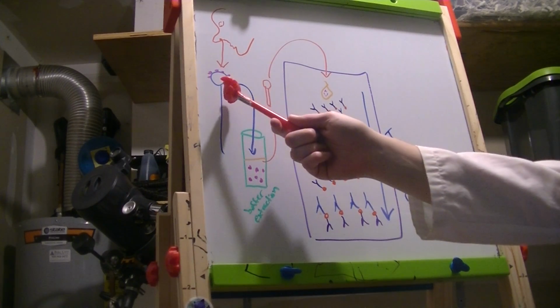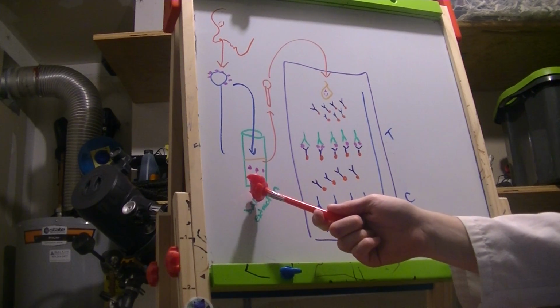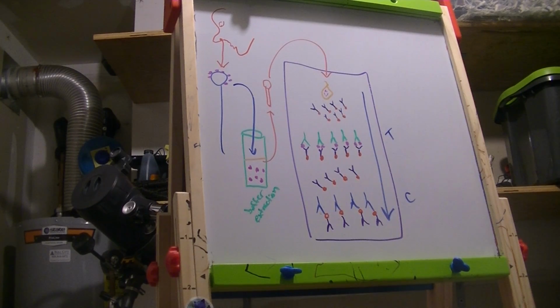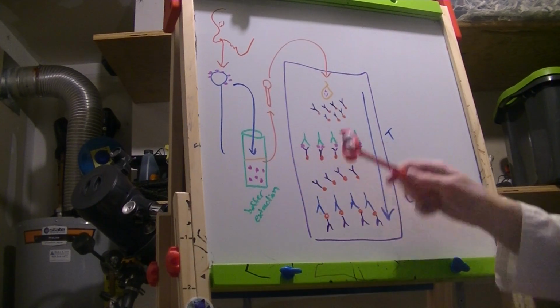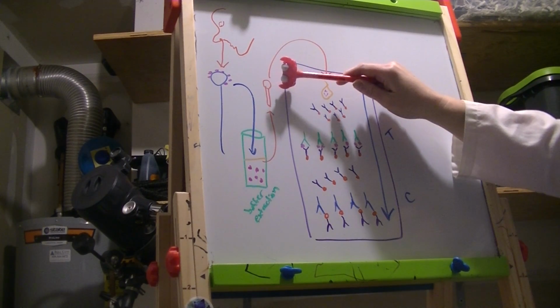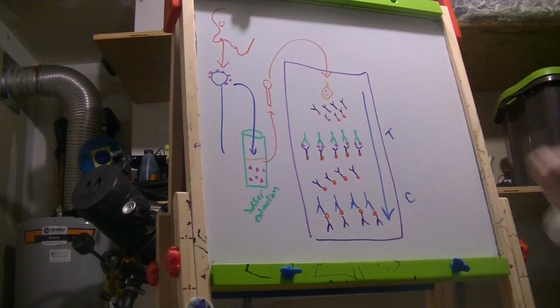The swab then comes to the lab and we put it into a buffer extraction solution, and any of those viruses and their antigens will then be in the solution. We then take our special little dropper transfer pipette and we take that solution and we place it in the card. So in the card is an immunoassay setup.